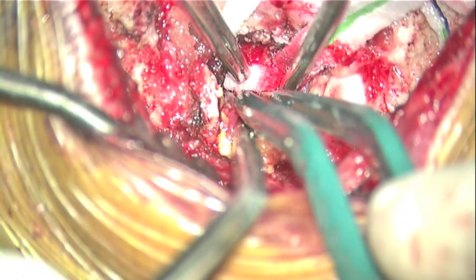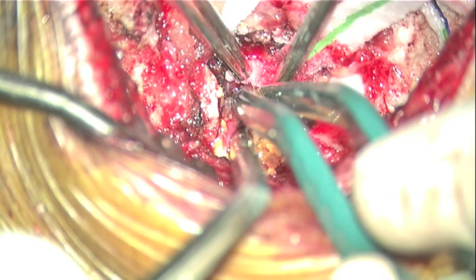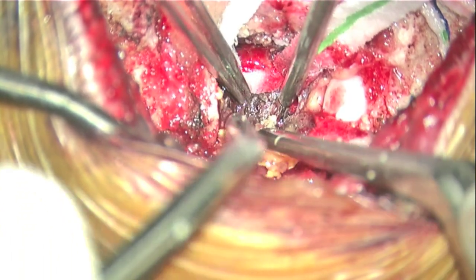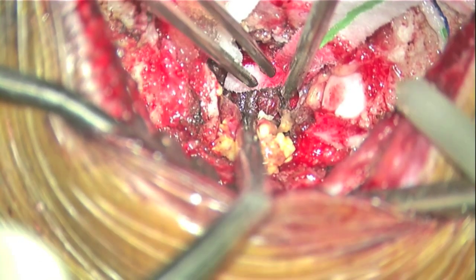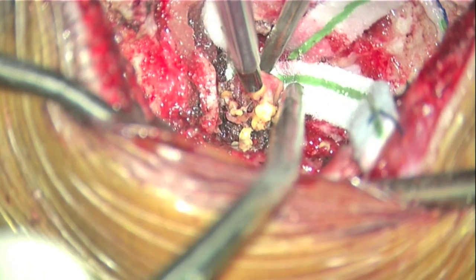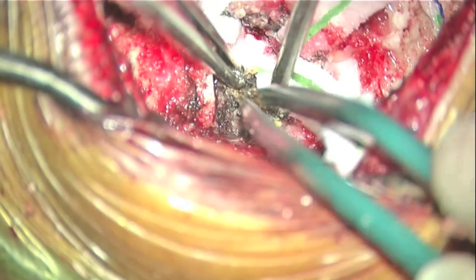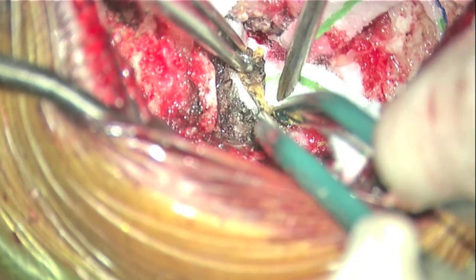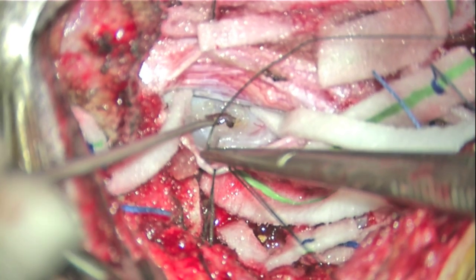Dissection of the ventral tumor margin is now completed with standard microsurgical techniques. The remaining lateral tumor margin is developed to complete the resection. Once the tumor is removed, the dura is closed.